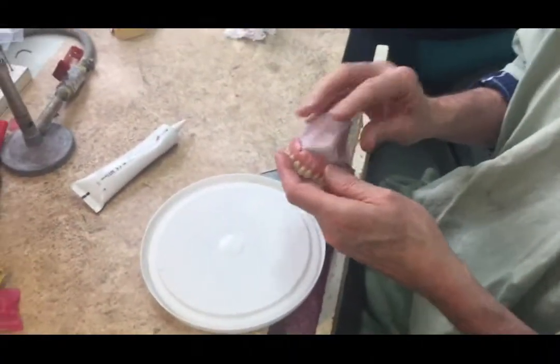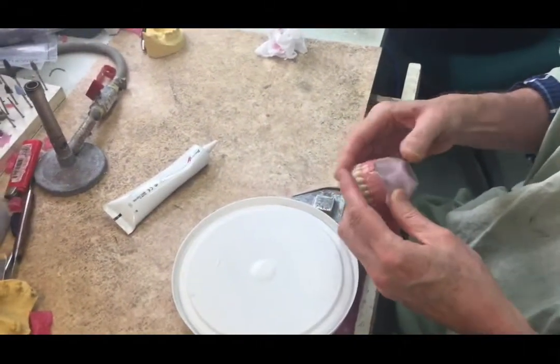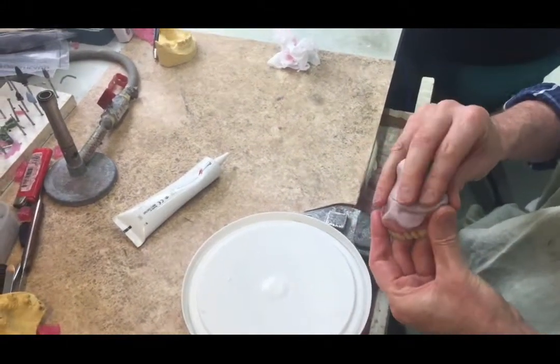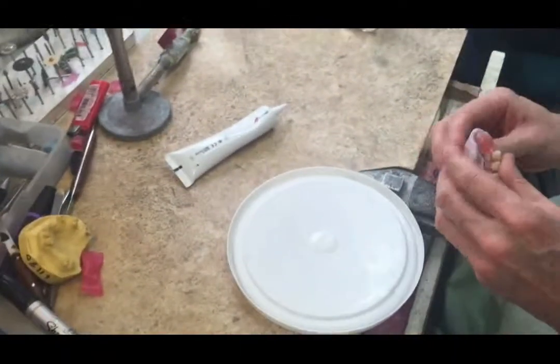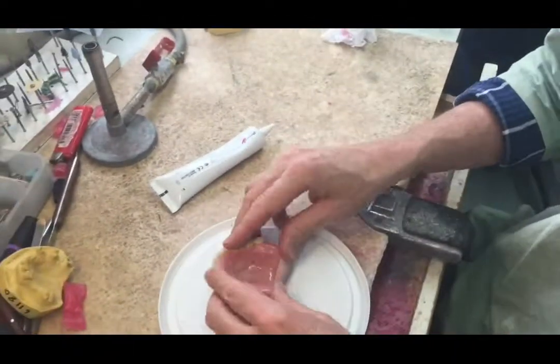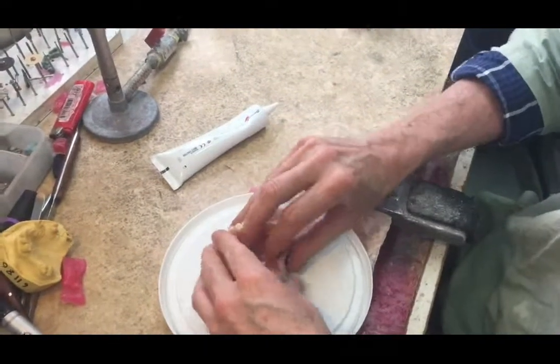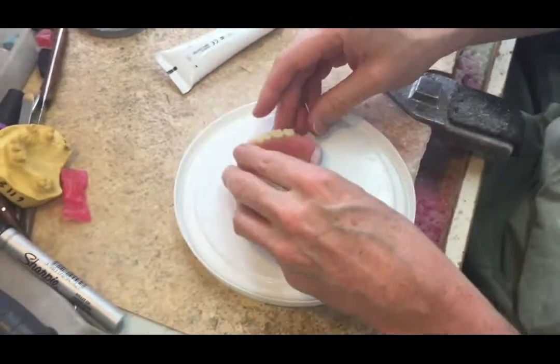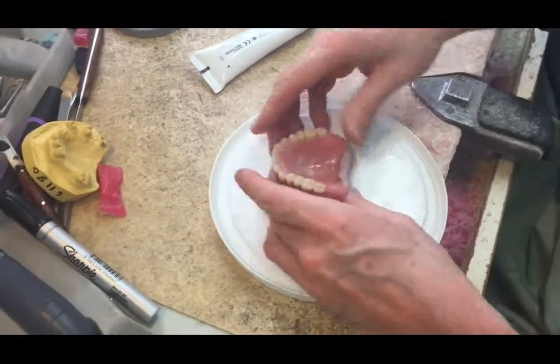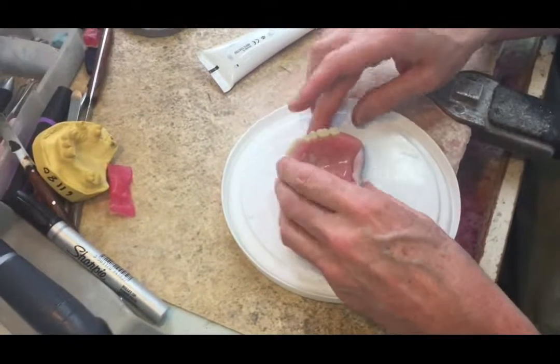Here we have the duplication of a full upper denture using laboratory silicone putty. We're mixing enough of course to make a model, and that will be the first part of this exercise. We have to put some sort of beam in so that the top part will fit into it, so we can make a solid mold.